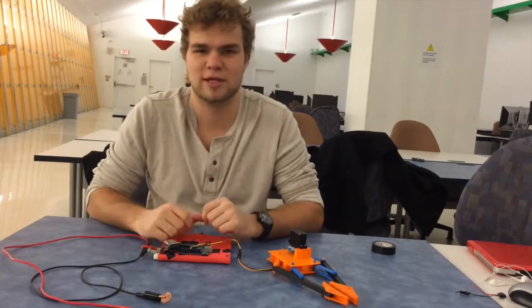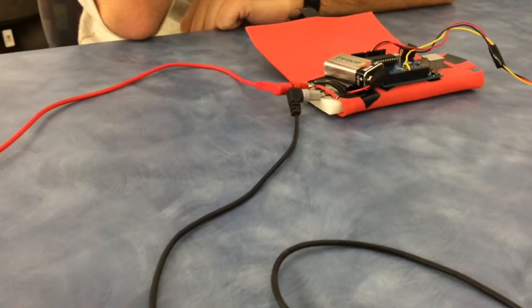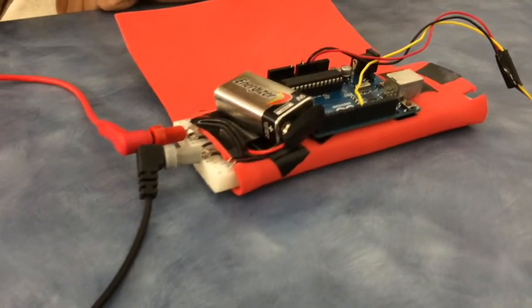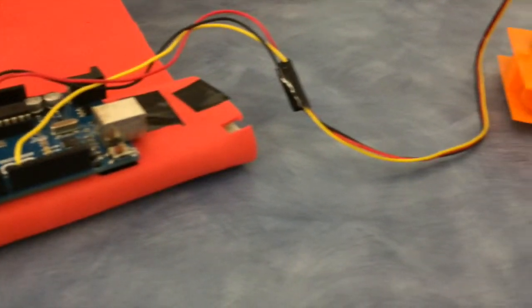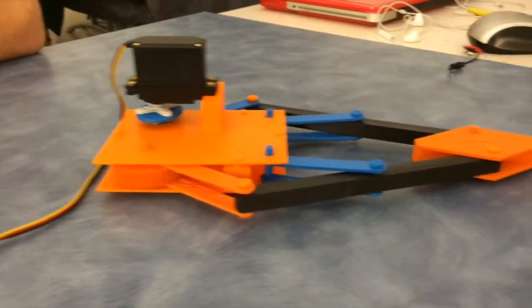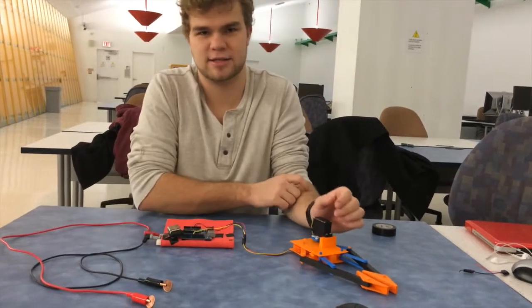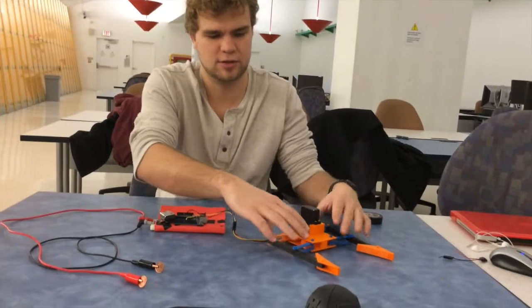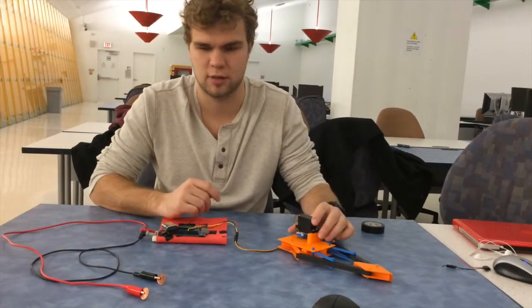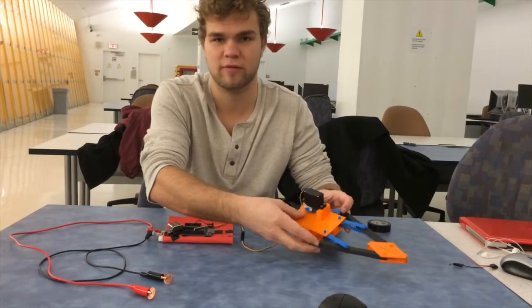separates the desired frequency, which is the frequency that your muscles operate on. This is then fed into our Arduino circuit, which is right here, and it compares this to a set value. So if a relaxed signal is sent through, the Arduino doesn't send a signal to our servo motor. So if a tense signal is sent to our Arduino here, it'll tell the servo motor to rotate a certain amount of degrees. In this case, I think we have it at 90, and then hold there, so it'll hold an object or whatever you want.